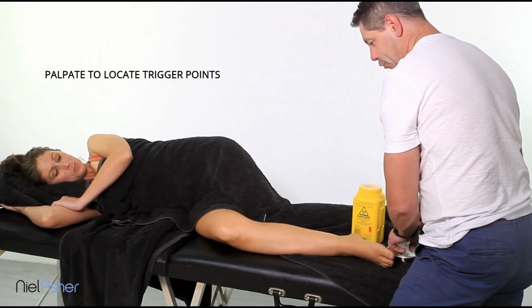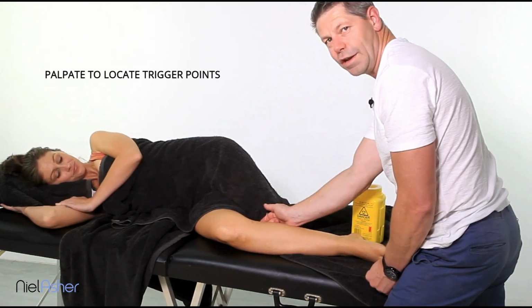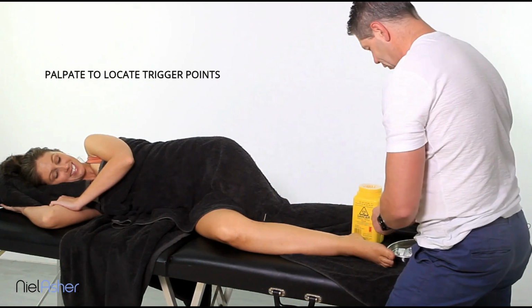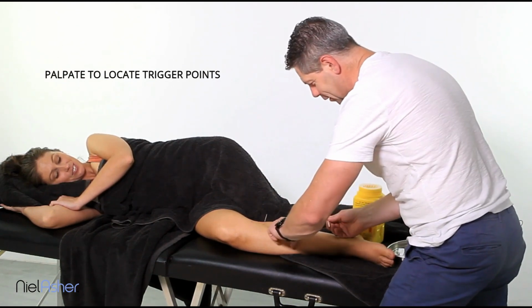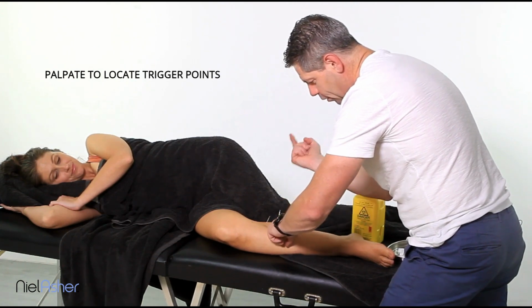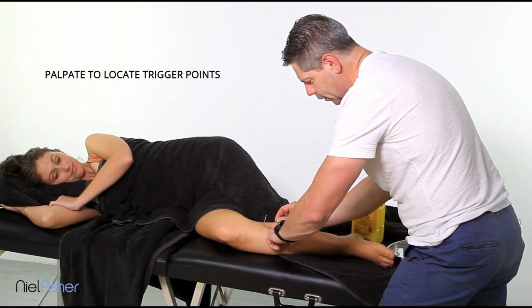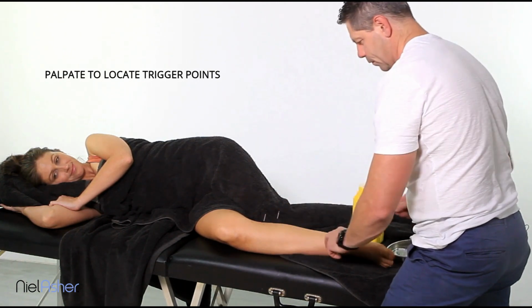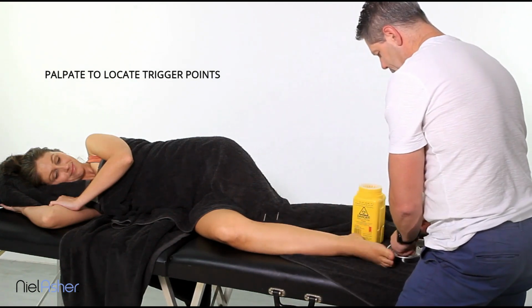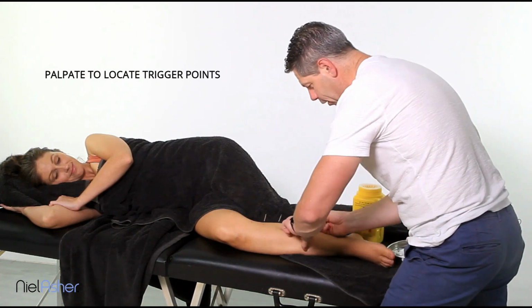Now, the reason we come in from the side and we don't go this way is to avoid any of the nerves or the neurovascular bundle. So I'm going to come down and hit that tib post now, which is down a little bit further. Once again, angle the needle towards the tibia, hit the edge of it, and then you're in. Push down.